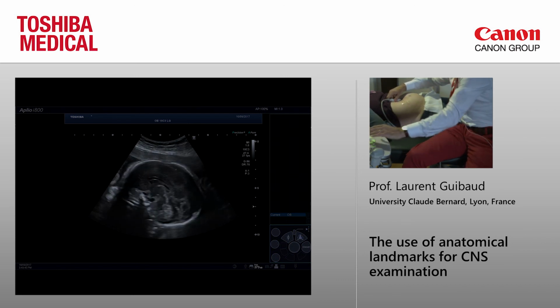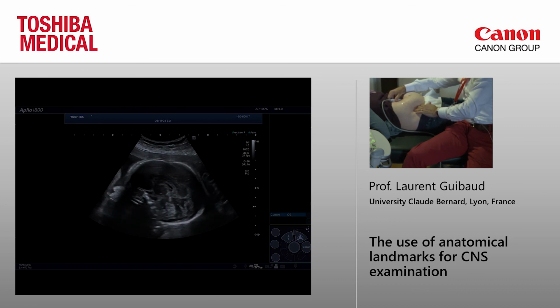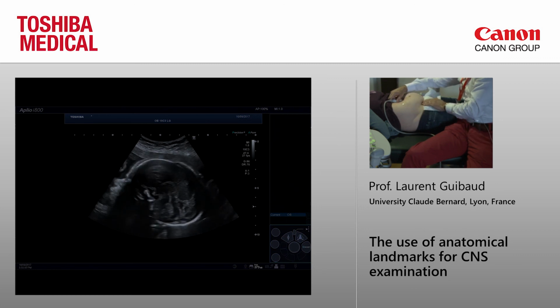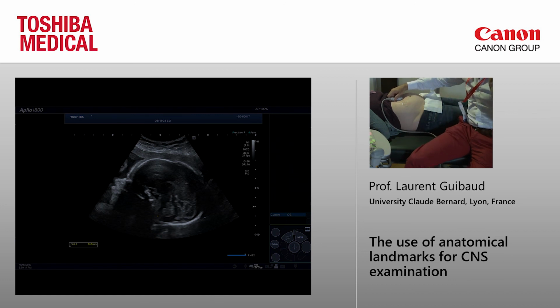And if we put my focal to the brainstem, okay, you see the vermis, and you see that the brainstem is a little bit tricky to analyze, because the anterior part of the brainstem, the pons, is more echogenic than the posterior part. So to have a good measurement of the brainstem using ultrasound may be very tricky, and we don't have this with MR. So I prefer to measure the brainstem on MR compared to ultrasound.